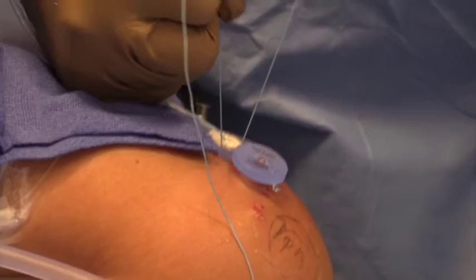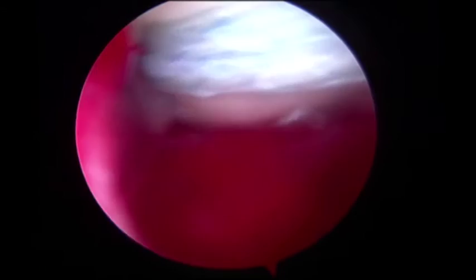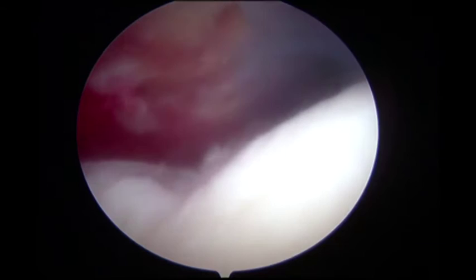The 3-millimeter dermal allograft was then gently seesawed into the subacromial space, utilizing the double pulley technique of the four sutures that had been placed. The two medially placed sutures from opposite limbs had been tied externally to allow for the seesaw capture.